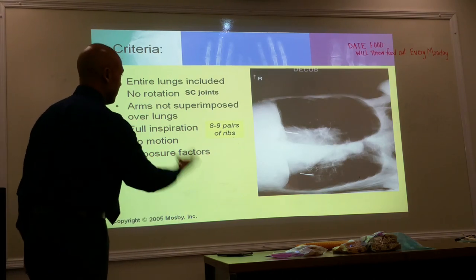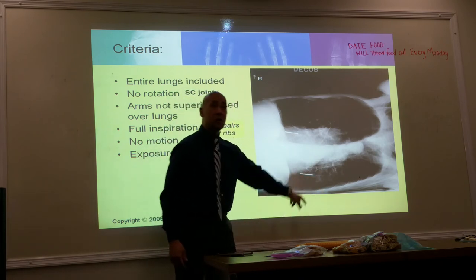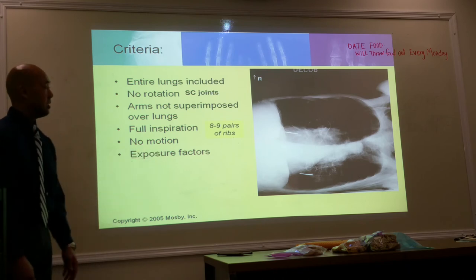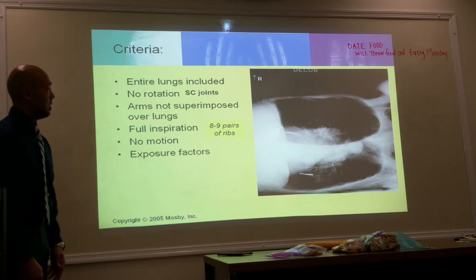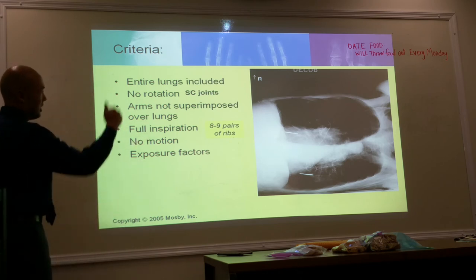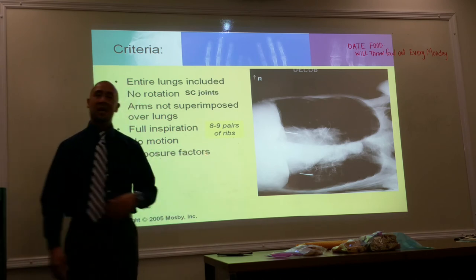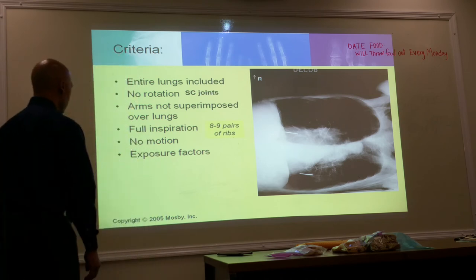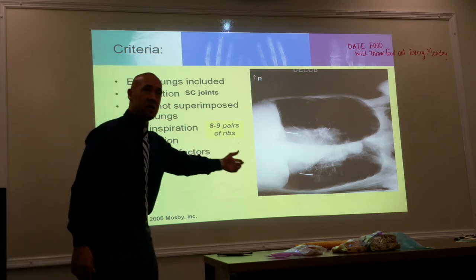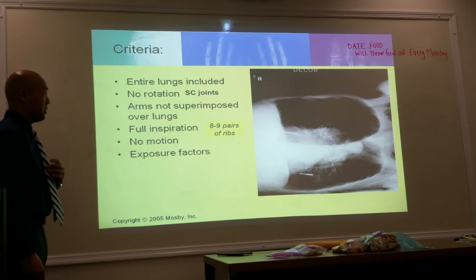Okay? So here is a left lateral decube. This is why it's important to prop the patient up, because if you don't, there's a likelihood that you will clip off the lateral edge of the lower lung. No rotation again, by evaluating the joint. You can't really see it here. Arms are not superimposed over the lungs, and full inspiration. Same thing here. You may only see between 8 to 9 ribs versus 10. Can't see any on that one, basically. Exposure factors: again, we want long scale. Is this long scale? No. This is black and white, and I can't even see lungs. All right? So this is a poor demonstration of a left lateral decube.